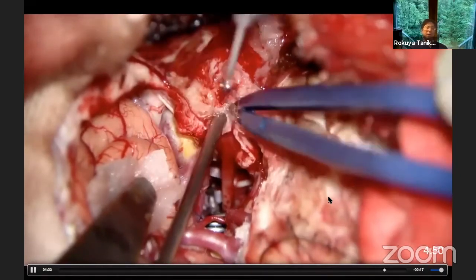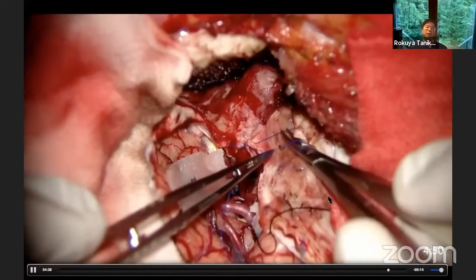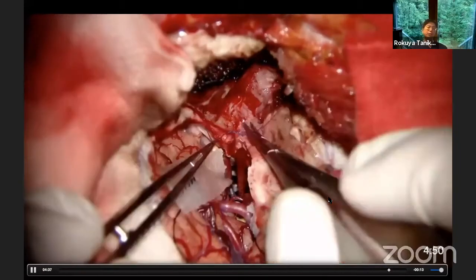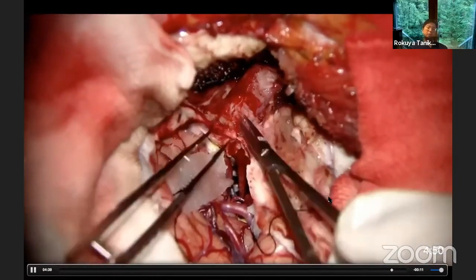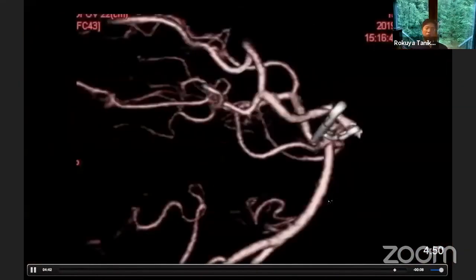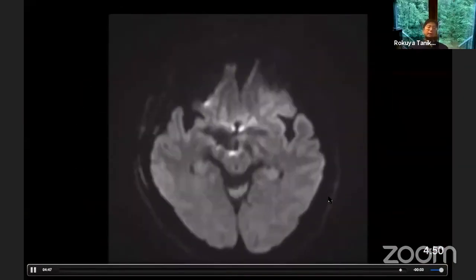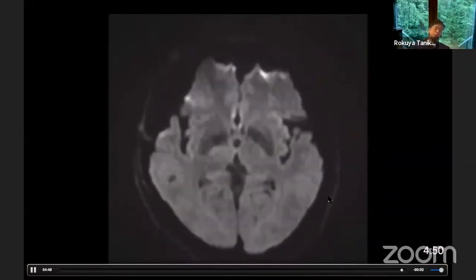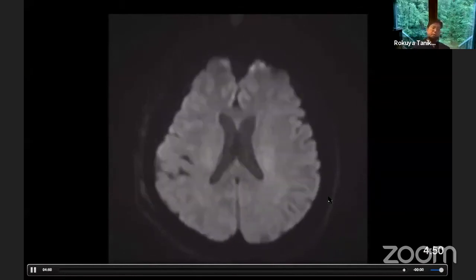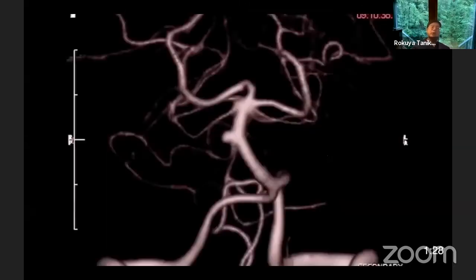The opened cavernous segment of the oculomotor nerve is then covered by dura propria and tucked, not to compress the oculomotor nerve. CT angiography shows good patency of the basilar trunk, PCA, and SCA, with no high signal on postoperative diffusion imaging.